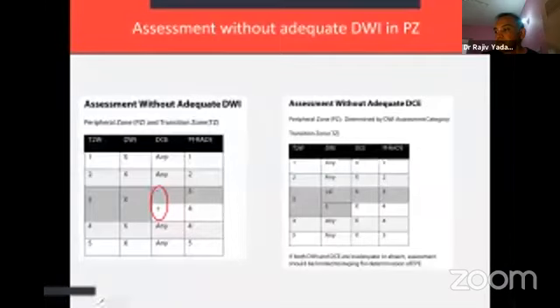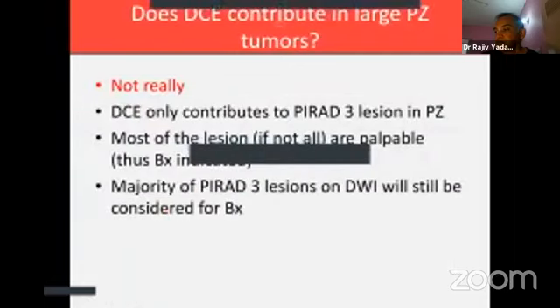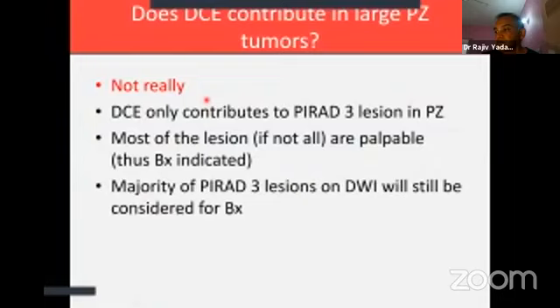So if the disease is palpable, if the DRE clearly shows that there's an abnormal DRE or there's a big, hard tumor in one of the lobes of the prostate, maybe both lobes of the prostate, it really doesn't contribute. Why should we unnecessarily spend money as well as extra time during the imaging, and also maybe get an unnecessary RFT done and the patient needs to go fasting.